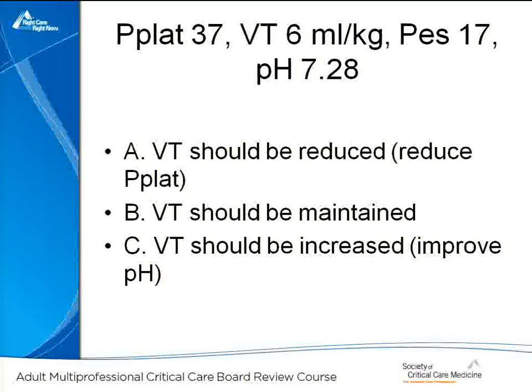pH of 7.28. So should you reduce the tidal volume to reduce the plateau? Should you leave the tidal volume alone? Or should you increase the tidal volume? 3 choices. Decrease, increase, or leave it alone.